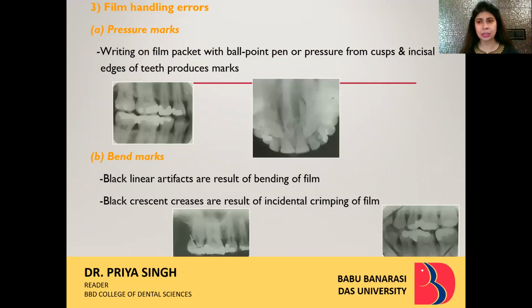Now coming to the third and the final error, which is the film handling error. Even if the technique has been done properly and the processing has been done properly, if after processing you are not handling the radiograph adequately, it can lead to errors. Again, you won't be able to interpret the radiograph.